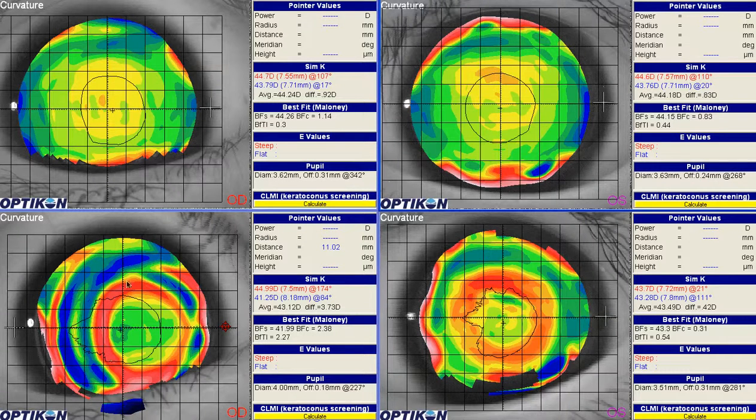In the right eye, the submitted post-wear refraction was plus a quarter minus 50, and so it's pretty close to plano. If you're looking for a plus 50 target post-wear refraction, you can build in a little bit more demand to this lens. But the main change I make to the lens in the right eye is to try to get it aligned better centrally.